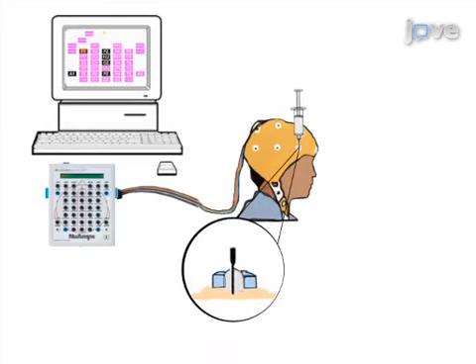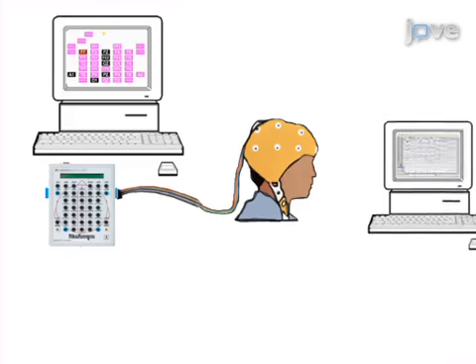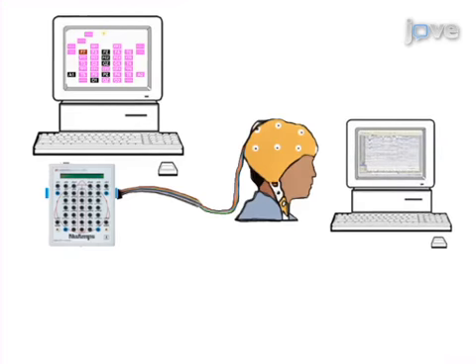Next, a needle is used to scratch the surface of the scalp to gain good impedance, as observed using data acquisition software such as NeuroScan. The final step is to record the EEG waves.